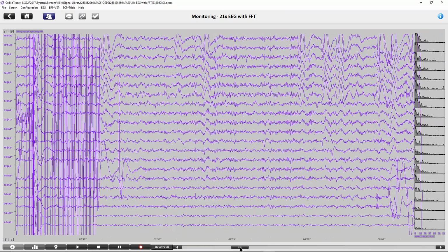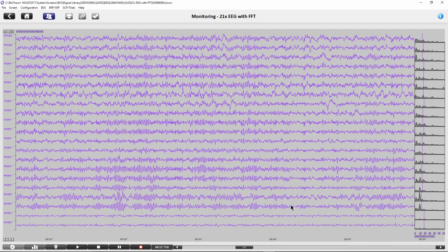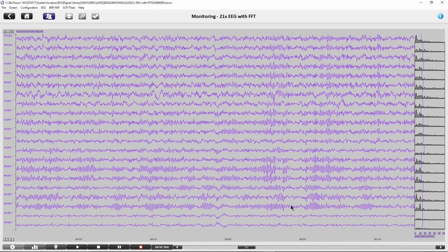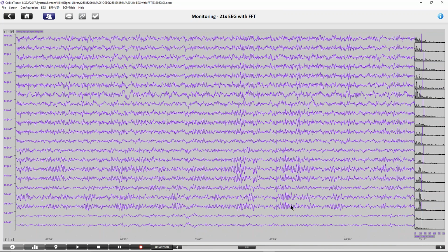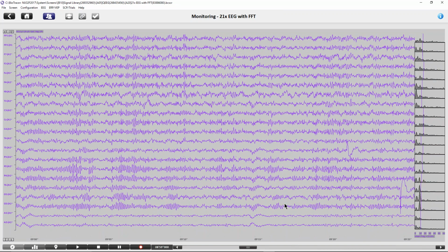Once we've done the recording and watched for eye blink, eye movement artifacts, muscle artifacts, drowsiness artifacts or events, pulse artifacts that you might see when a sensor is over a blood vessel, for example. Those are all possible events that you might see. You are more likely to see pulse artifacts in the temporal electrodes like this one at F8.